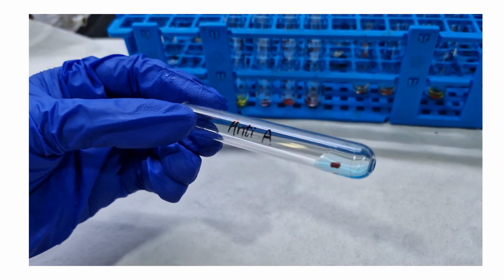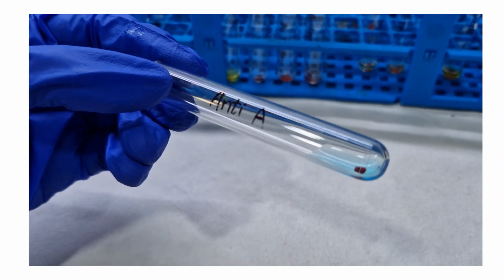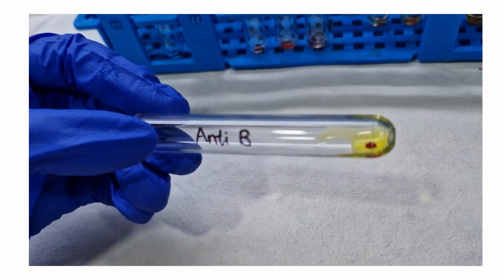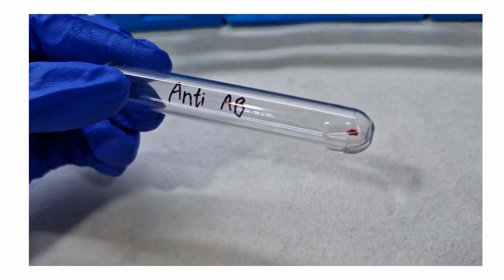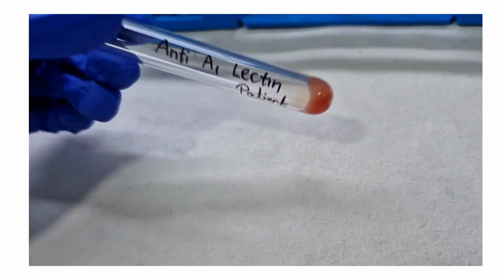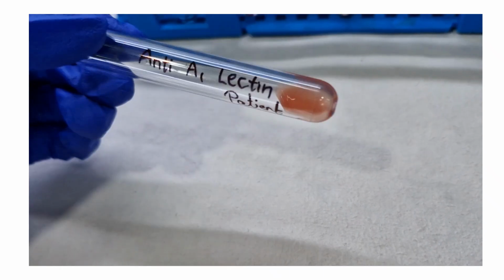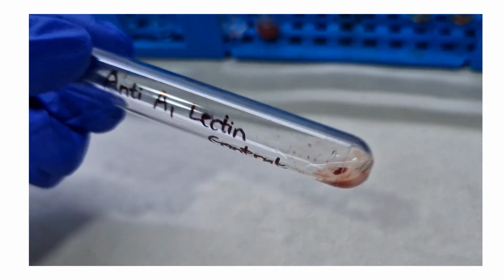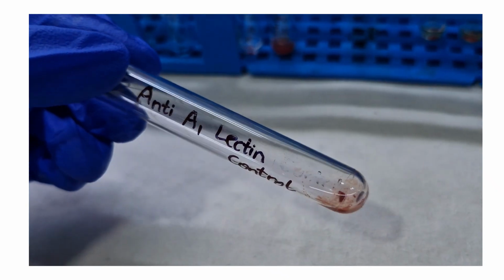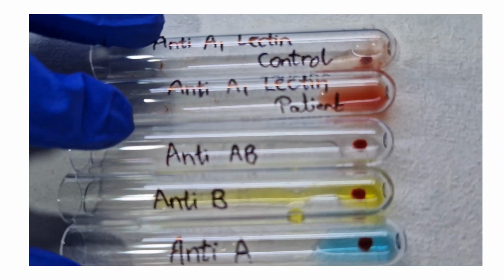In anti-A, there was a strong 4 plus reaction. In anti-B, there was a strong 4 plus agglutination. In anti-AB also, there was a strong 4 plus reaction. In anti-A1 lectin patient, there was no reaction, whereas in anti-A1 lectin control, there was a strong 4 plus reaction.